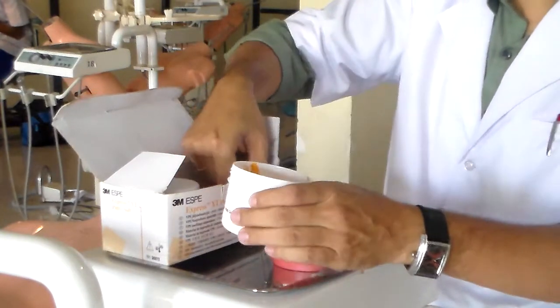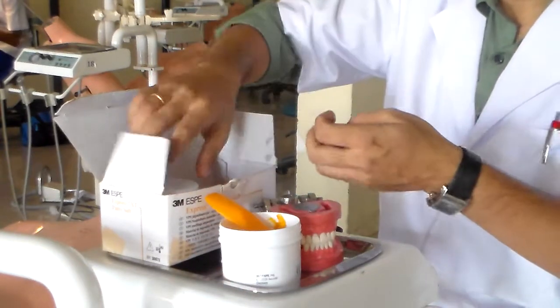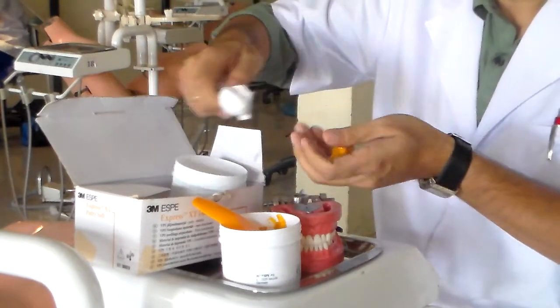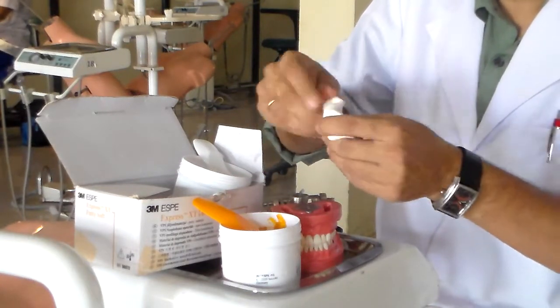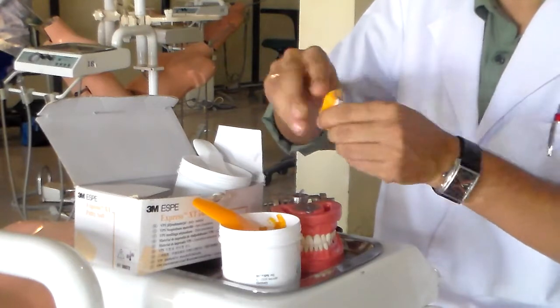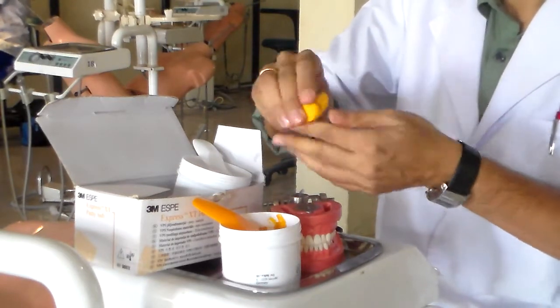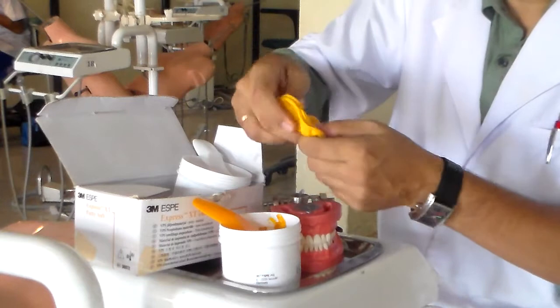I'm going to take some putty material and take a little scoop of it — the other one as well. You must have equal amounts of this. You must not use a glove, because the sulphur contamination from the latex glove is going to inhibit the setting reaction of this addition silicone. You're going to knead it, just like you would knead any sort of dough to make bread. Once you knead it well, it becomes a uniform colour — no streaks.